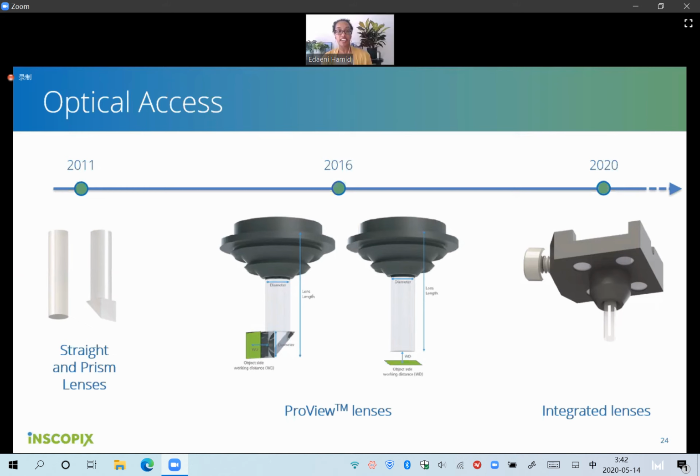It is, yeah. And the electronic focus, it's two sides to it. One is once you've done your lens implantation, again, we're talking about obviously you want to optimize, make sure these things are well done. And the second part though is the full range is 300 micrometers. So as long as when you've implanted, you are within that range, you can go back and forth.